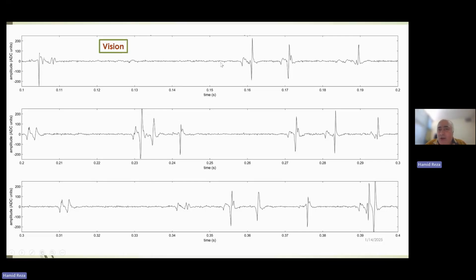So I continue all of these procedures over time, and I try to match the new active segment to those that have already been identified. I either merge them together and then update the cluster, since when I update the cluster, I follow the electrode movement, because during recording, the electrode might move.